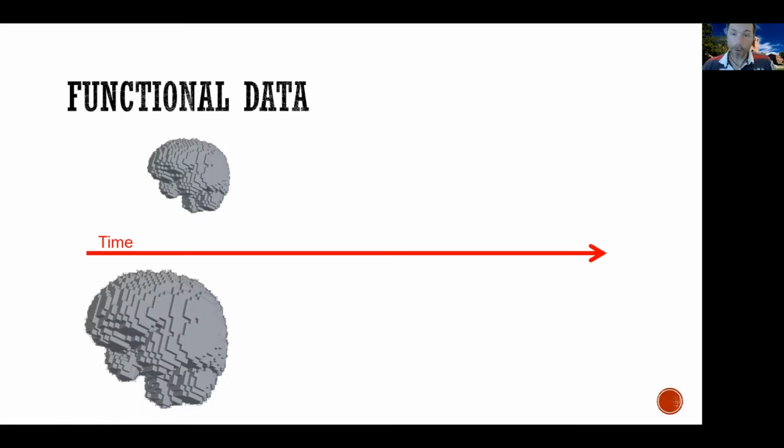When thinking about functional data, there are typically two different ways of conceiving of these data, or there are two different intuitions in terms of representing these data. One is more spatial in nature, and one is more temporal in nature. But throughout this lecture and the following ones, it'll be convenient to sometimes think about one of the two, and sometimes think about it with the other representation. So I want you to have both intuitions, and I'm going to portray on this slide both intuitions.